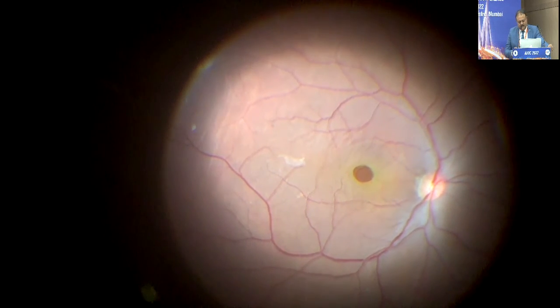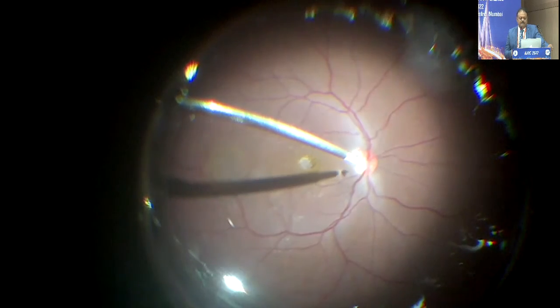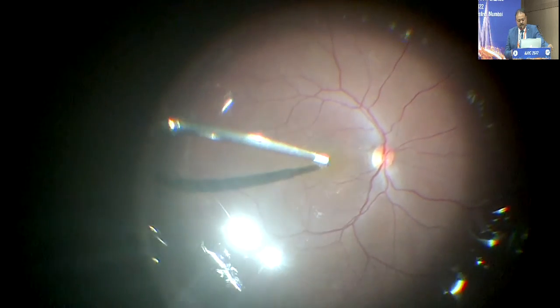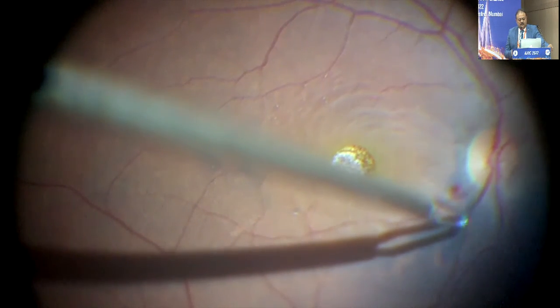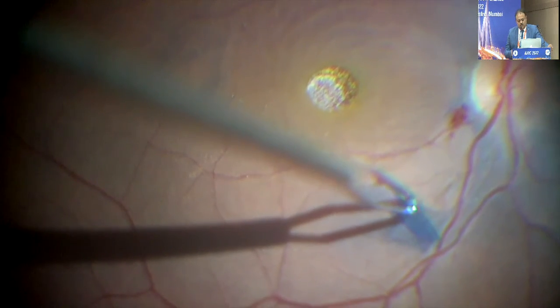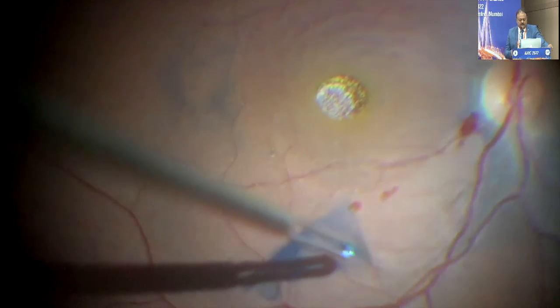And coming to the last scenario, where we get a failed macular hole. There are also various methods. We can do a free flap. Sometimes, like in this case where we have not done the primary surgery, we should always stain and see how much peeling has actually been done. So if you see that it is not done from arcade to arcade, this is what we can do: do a re-peeling and do a very good fluid air exchange with gas tamponade.